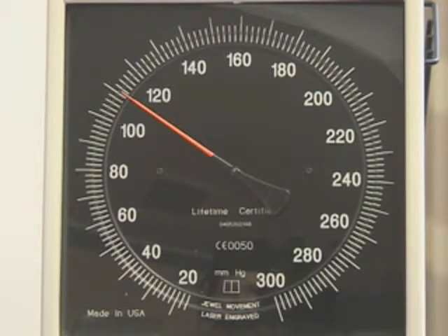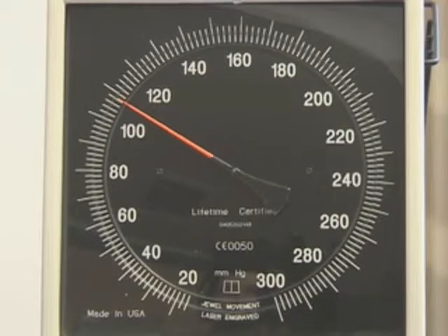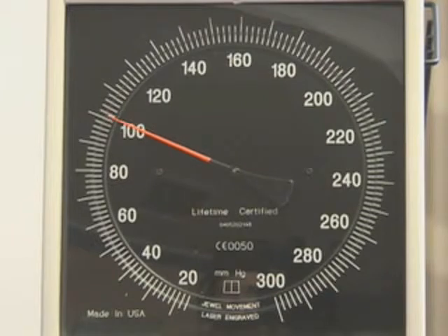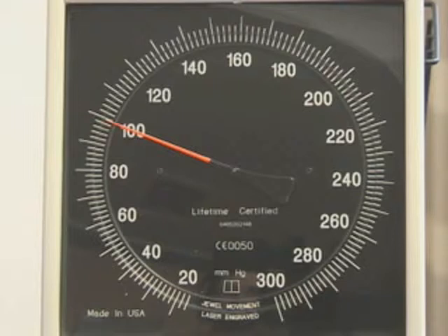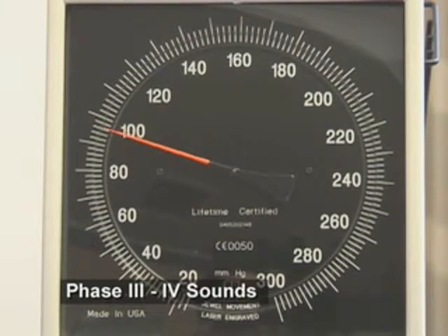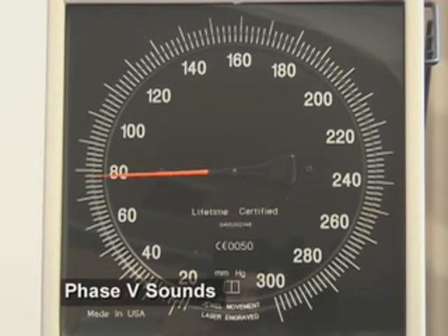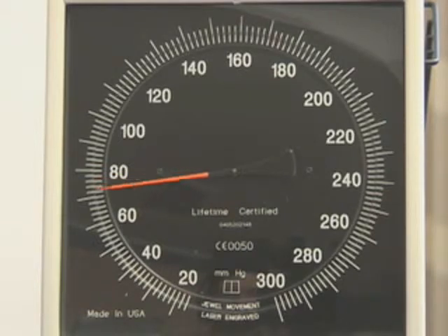Phase 2 sounds are audible murmurs in the tapping sounds. Phase 3 and 4 sounds are muted changes in the tapping sounds that occur as the pressure measurement approaches the diastolic pressure, usually within 10 millimeters of mercury of true diastolic pressure. Phase 5 sound is not really a sound, but rather is the level at which sounds disappear. Phase 5 indicates the diastolic blood pressure.